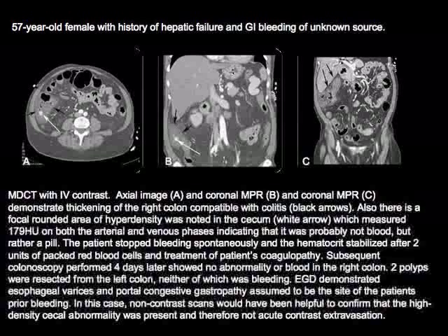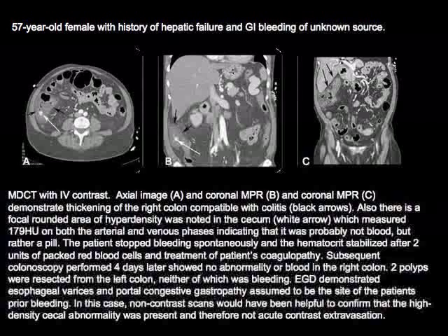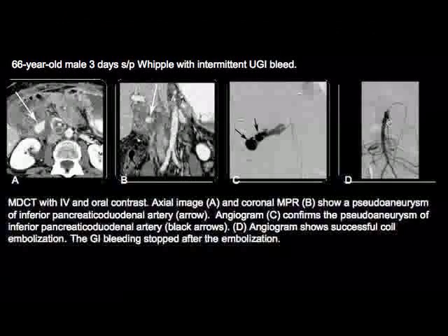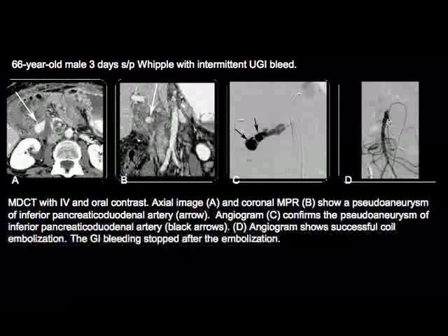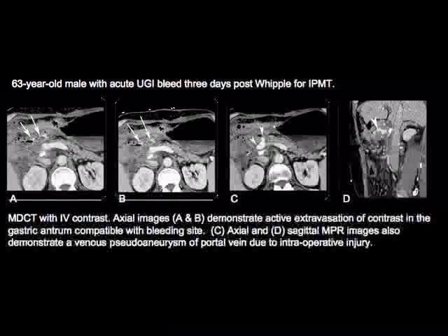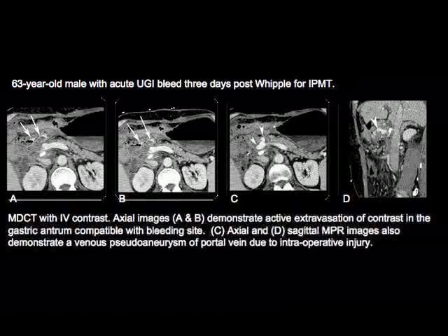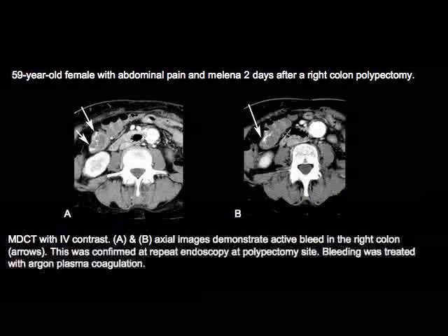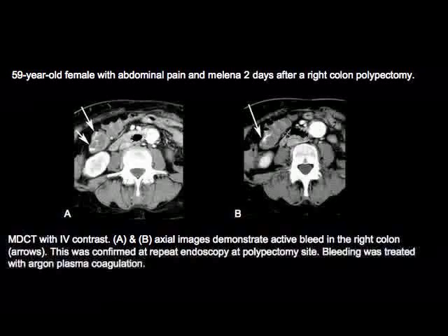It turns out to be a pill in the colon — a true bleed changes density from arterial to venous phase, which is why performing a non-contrast scan first can help. Another case: a patient post-Whipple procedure with a pseudoaneurysm of the inferior pancreaticoduodenal artery, nicely shown on CT angiography and confirmed at angiography with embolization performed. Another post-Whipple case shows very bright areas of active extravasation standing out against water in the bowel.